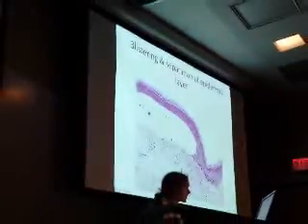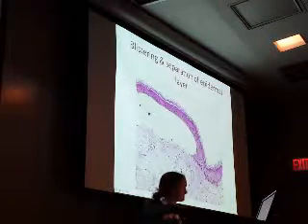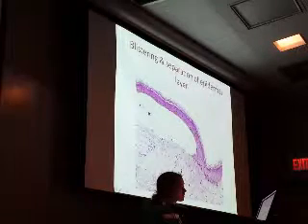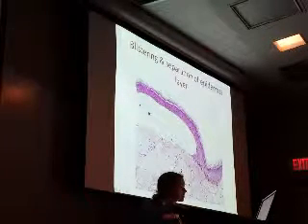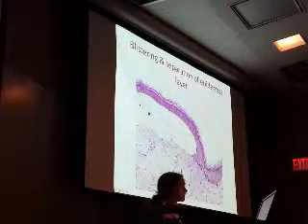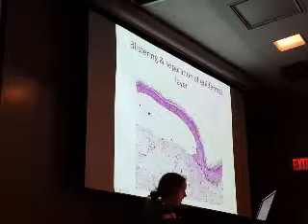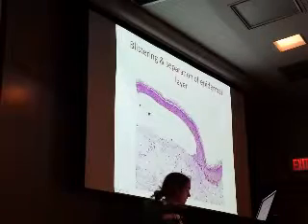the situation. So there is separation of the layers, right? And I think that's really clear here. So here is the outer layer separating from the underlying layer, the outer separated and blisters formed here.